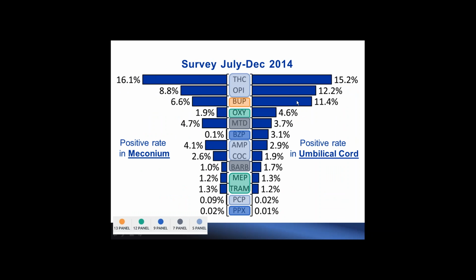So this is the prevalence of the drug types, where which panel each drug type belongs to are color coded. I really think that it depends on what physicians expect to see, and see if the extended drugs are valuable for you to add on.